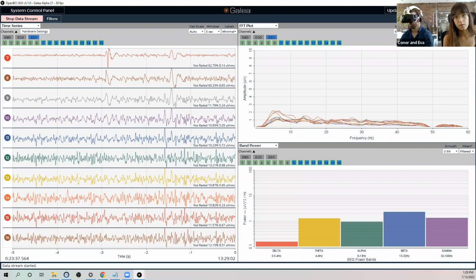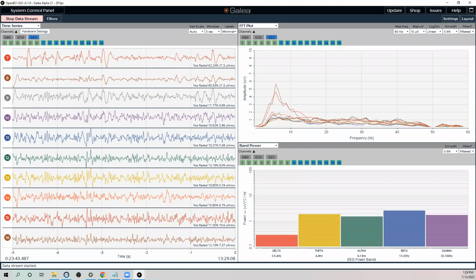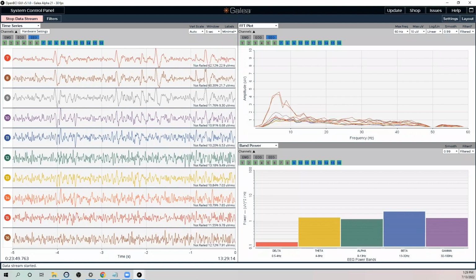We had another good question actually that's worth pausing for. Someone joined late and asked, are the channels dry, active electrodes, passive gel, or saline electrodes?